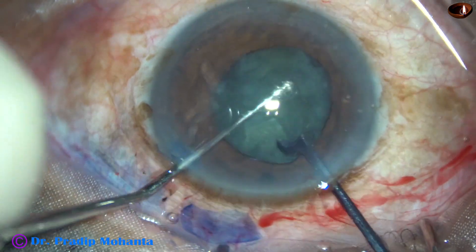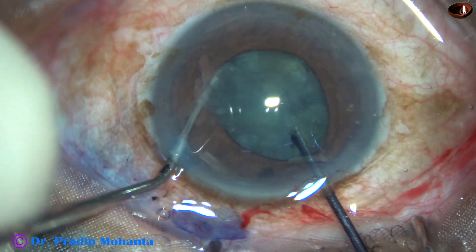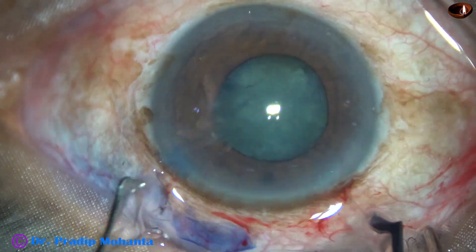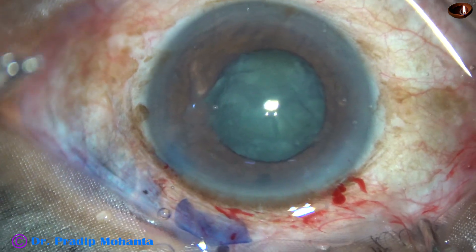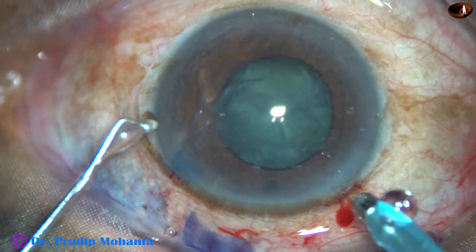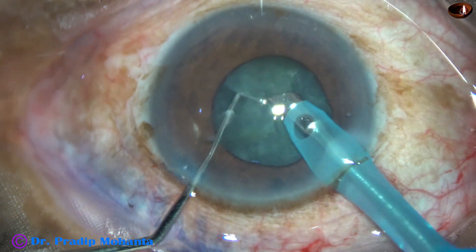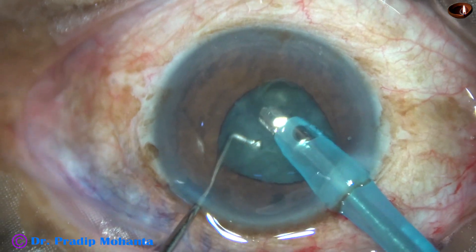Now the other heminucleus is being attempted for division. It is divided — it is just a crack, it is not fully separated. The pieces are still joined but still we can manage because we have got two completely separated heminuclei. Now see as I use vacuum.